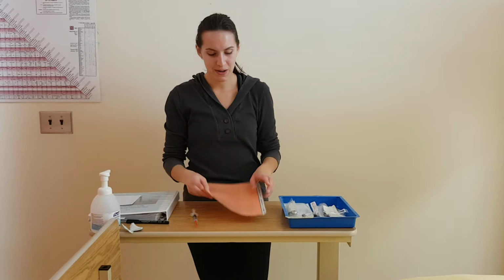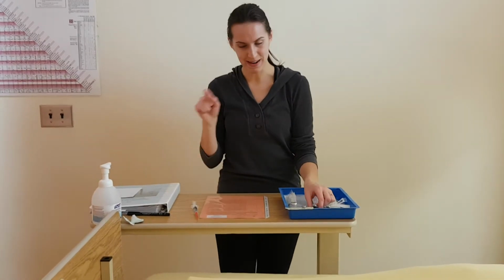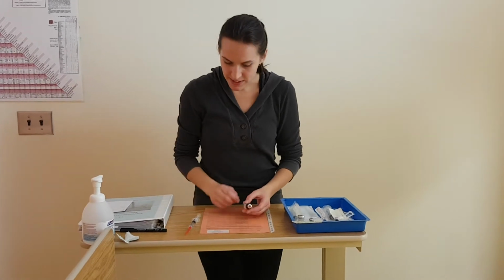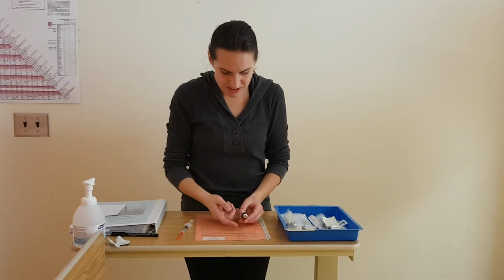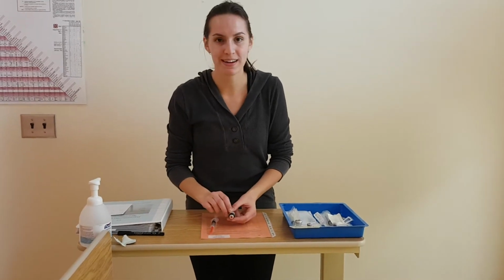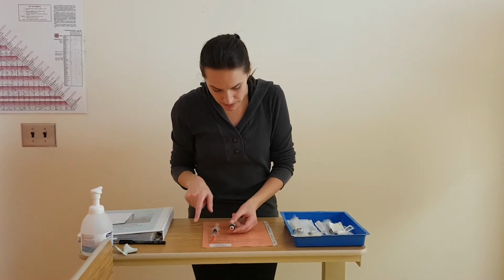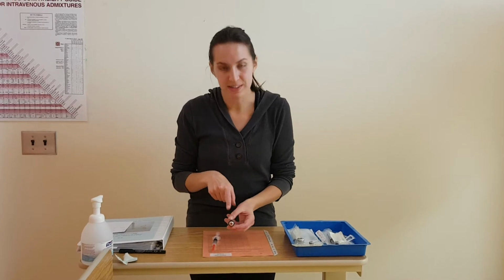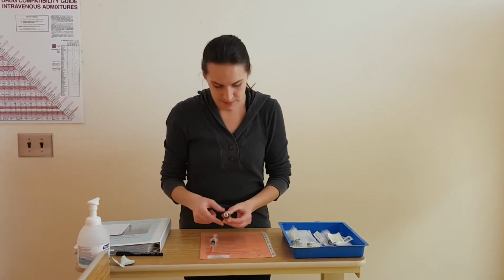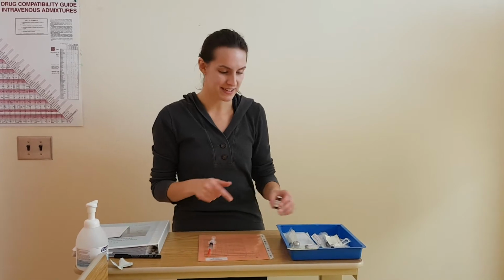At this point, I'm going to do my second medication check, comparing my MAR to my vial to my medication that I've prepared. So I see here that I have the right patient, Emma Wrightson. She has an allergy to morphine. I have the correct medication, Lasix or furosemide. The correct dosage, 40 milligrams. And since this concentration is 10 milligrams per milliliter, I have to draw up 4 milliliters in order to get 40 milligrams. IV, and it's being given once at this time right now.